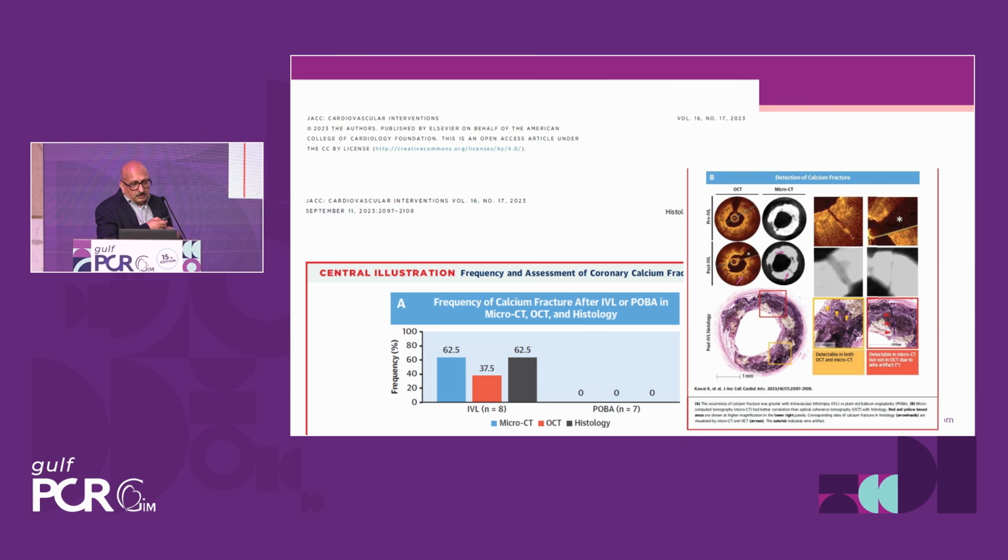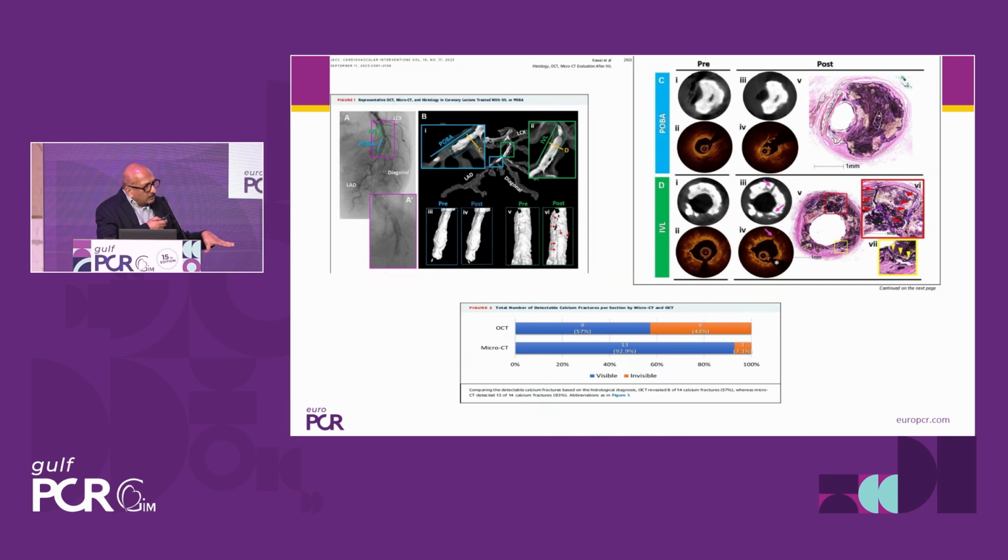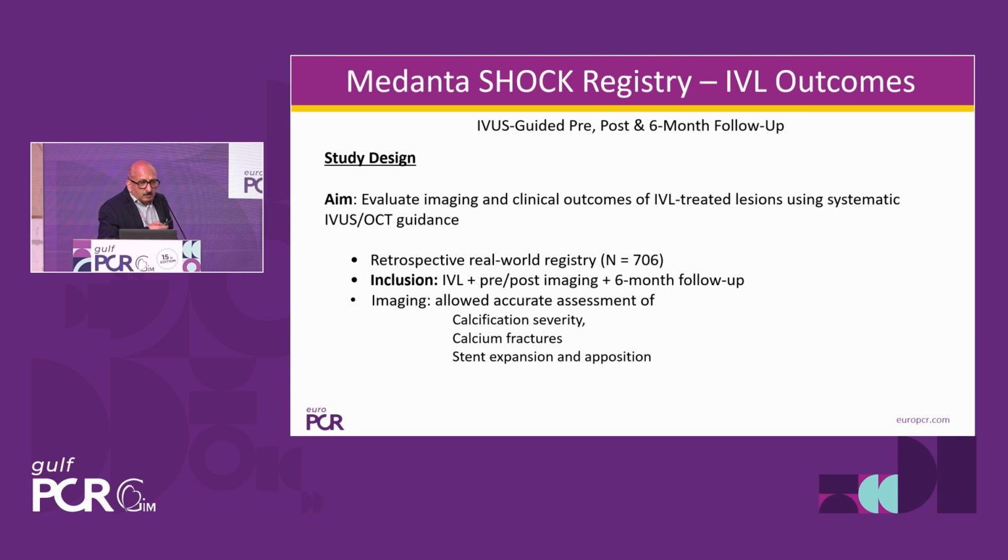And then of course it was studied, as was also shown in a cadaveric example, that when you do a micro CT, you see that much more calcium disruption happens, much more calcium fracture is seen, as we cannot see everything on OCT or routine angiographic evaluation.